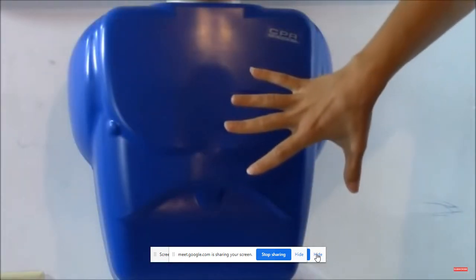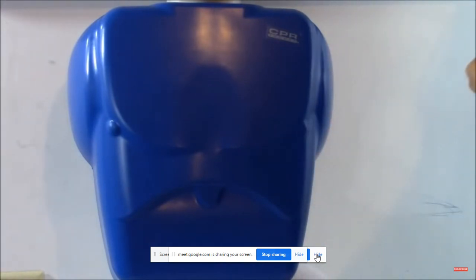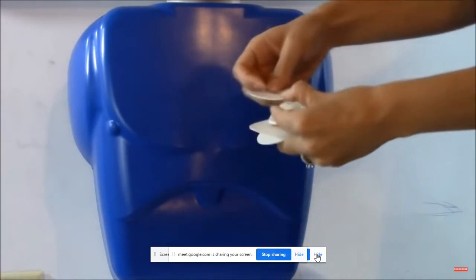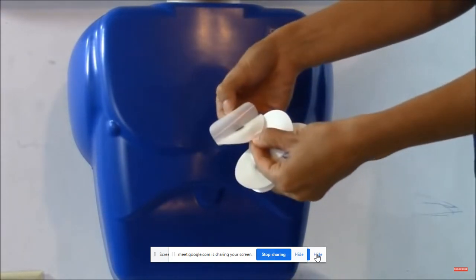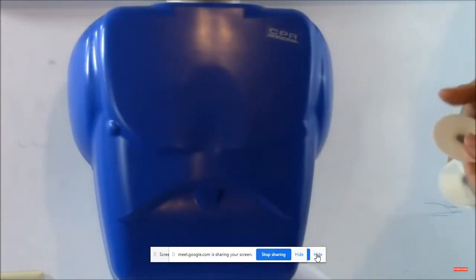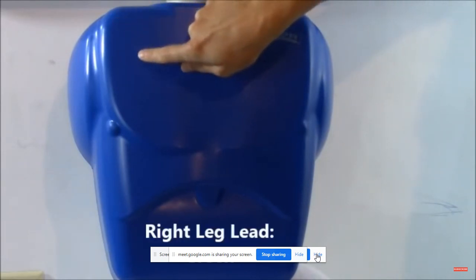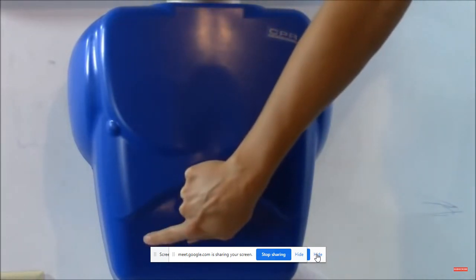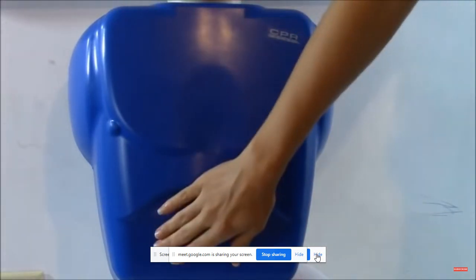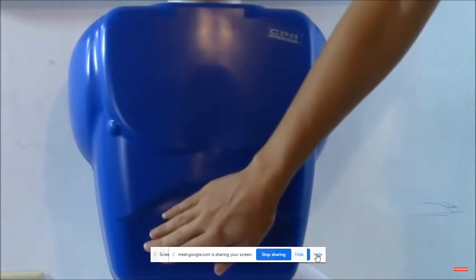Okay, you'll want to expose the chest, and you'll get your telemetry box, you'll put the battery in the box, and you'll get your sites ready to put your little electrode stickers. Now, on the back of each electrode is a little backing that you'll have to peel off, like that. And first, I like to start over here on the right side. What you have first on your right side is your right arm lead and your right lower leg lead. And this will be white and green. How I like to remember that is snow, which is white, over grass.